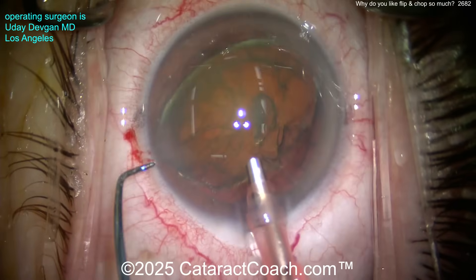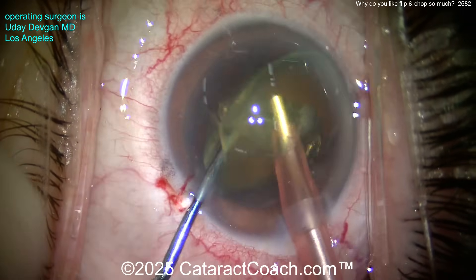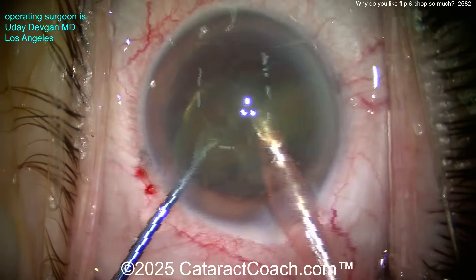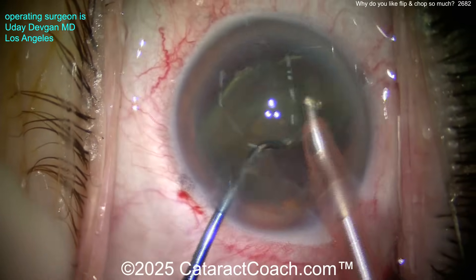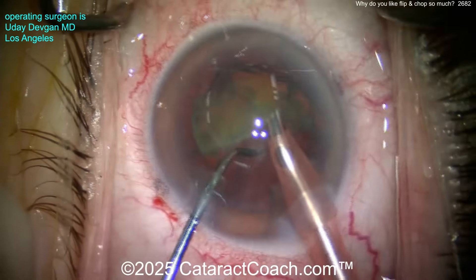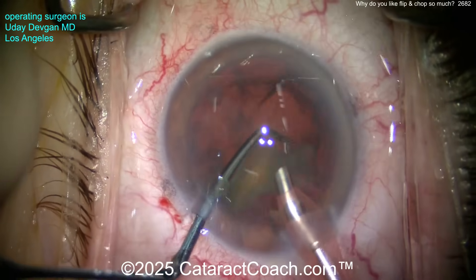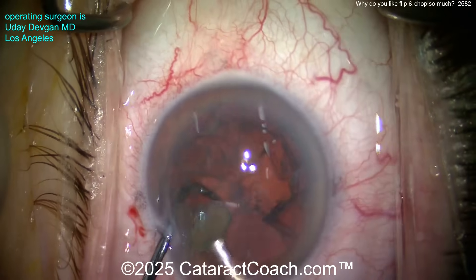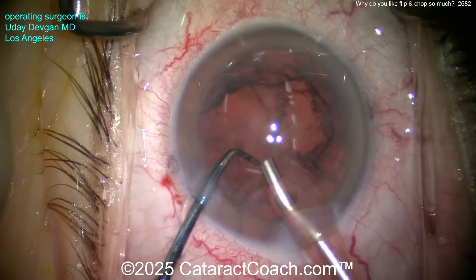Here comes the phaco probe and the chopper. High flow settings, high vacuum — about 40 cc per minute, at least 400 mmHg vacuum. Just chop and separate. You've got two halves. These halves are relatively soft and easy — you can just aspirate them down and don't even have to sub-chop them into smaller pieces. It's super efficient. I also like that we're away from the capsular bag — I don't want to risk breaking it. That's just gone; the nucleus goes away instantly.